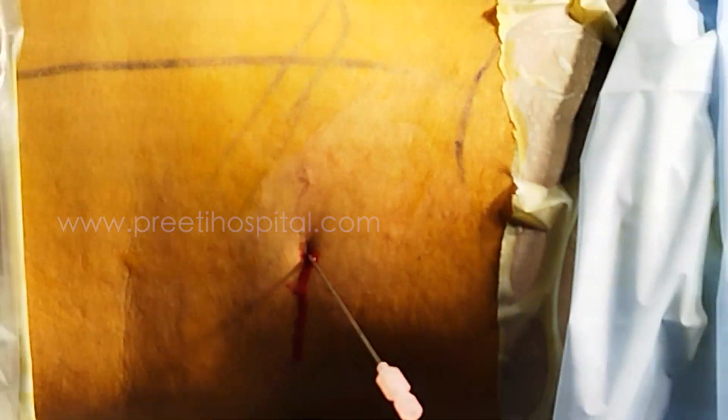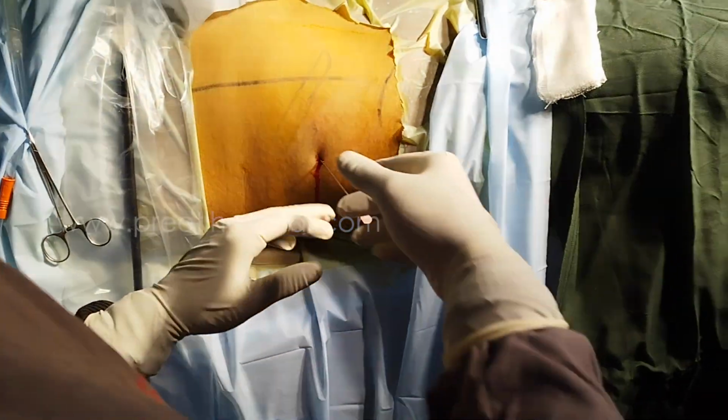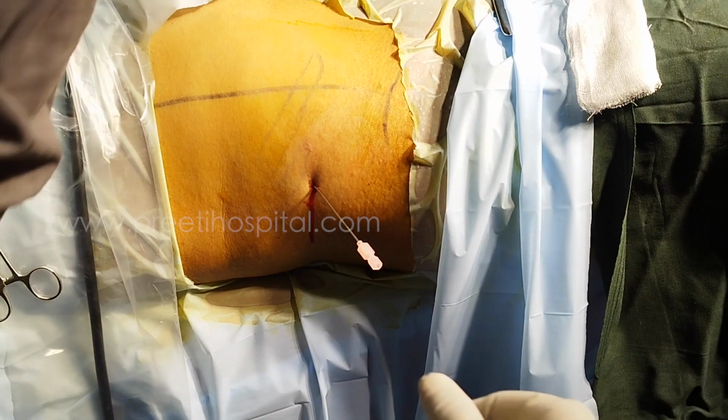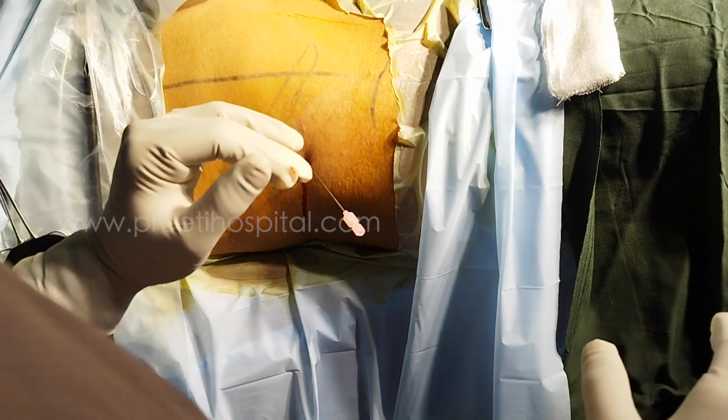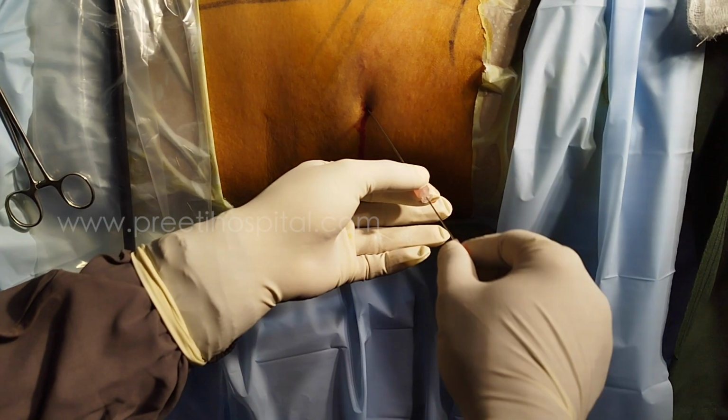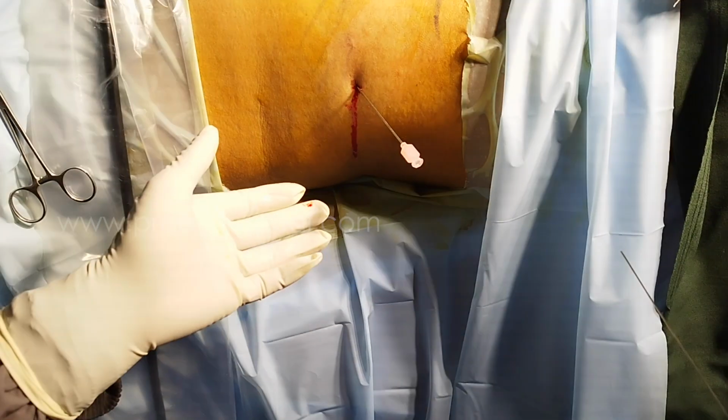If the water doesn't come, what will you do? Go a little posterior. Don't remove everything, only half a centimeter. You go posterior because slightly, still it may be there also. We never know. So what I do is first I will remove it. If it comes, it's okay.